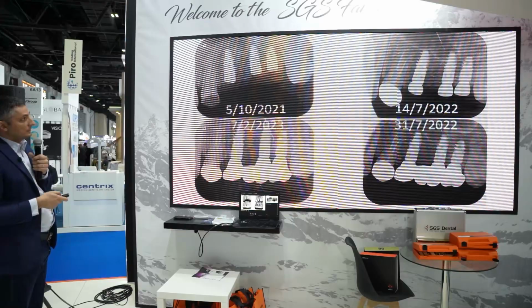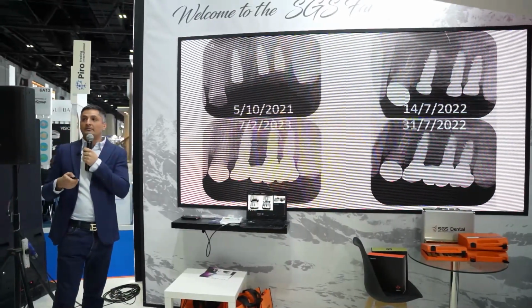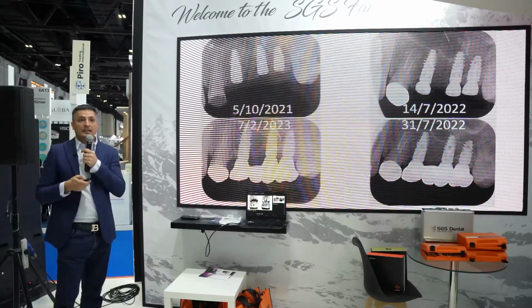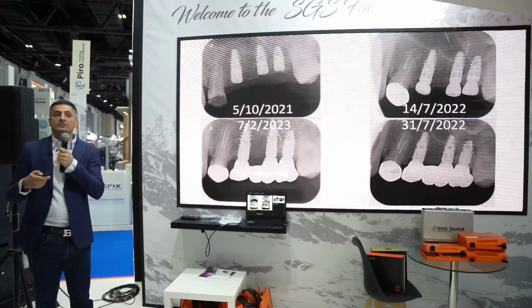And still with all these cases, I'm using the same drilling protocol. If I'm not using this drilling protocol, what will happen? I might have more bone resorption, and for sure the implant will fail, or the implant will fail very soon.